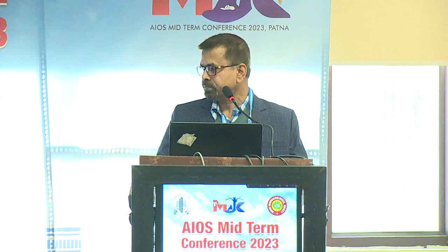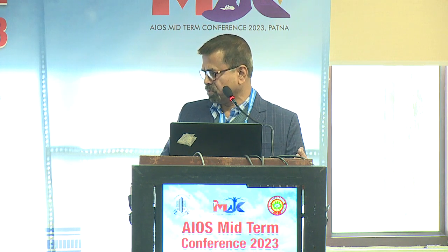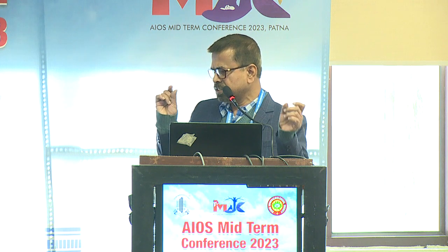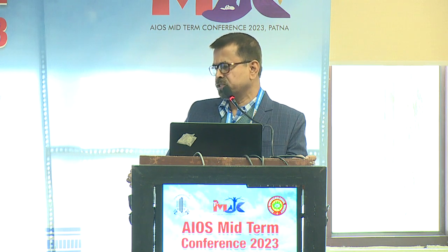Okay, right. And a sharp chopper is necessary? No, not a sharp chopper. This is a very small chopper, normal chopper. It's designed by me. It's just a modified Sinskey hook. It is about 0.6 to 0.7 millimeter long. And the tip is sharp? Tip is not sharp. It's blunt.